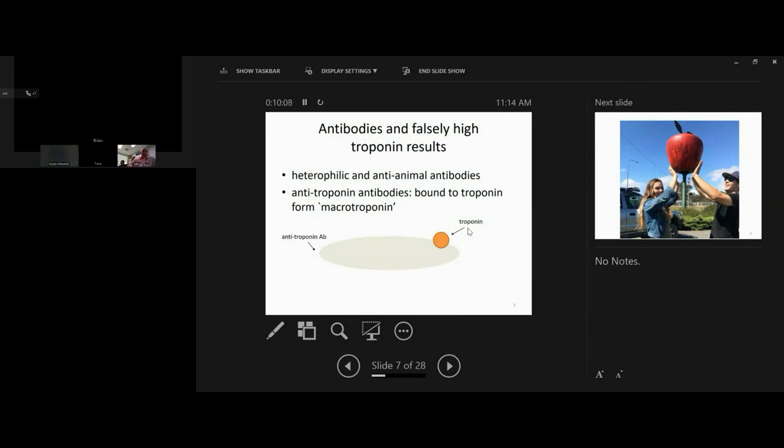It all comes back to antibodies. Now, as you know, all the troponin assays we use are based on antibodies that recognise and bind to troponin molecules. Antibodies are really useful in assays because they're good at binding to things, sticking to other molecules. But, of course, patients have antibodies too. And sometimes they have antibodies that stick to reagents in the assay and muck it up. As a general rule, when antibodies muck up an assay, they can make it read either too high or too low. But usually, certainly in the case of lab troponin assays, it's really only the falsely high ones that the doctors ever tell us about. Now, I know that's different from the point of care experience, so just hold that thought because we're still talking about lab assays for a while.